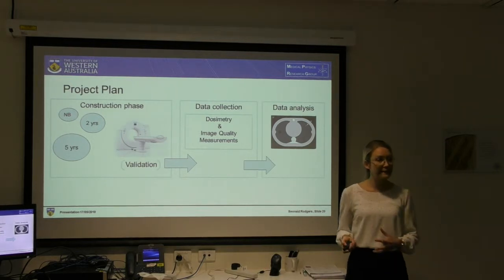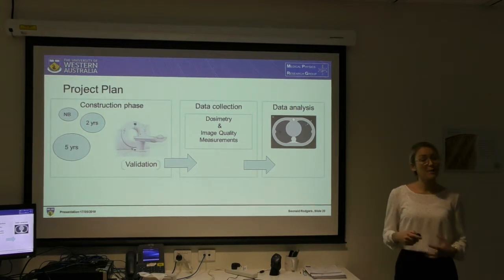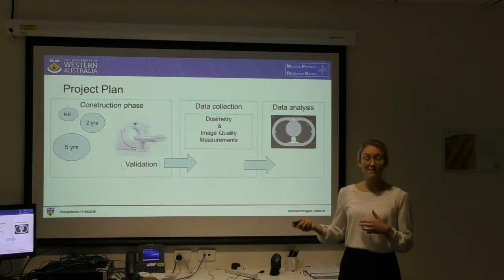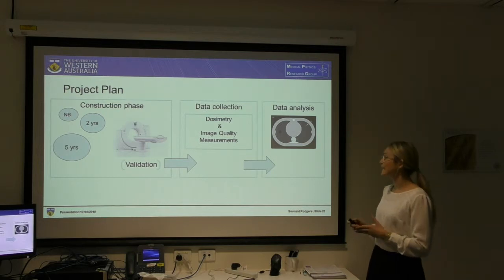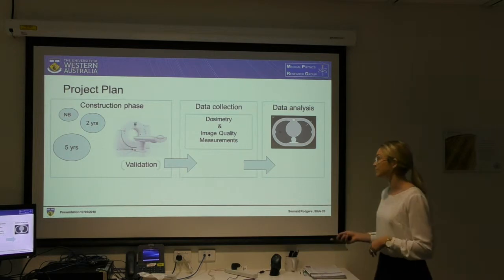My project plan consists of 3 main stages. Firstly, the construction stage, where I will be making paediatric chest phantoms. Once these phantoms have been validated, we'll be using them to take dosimetry and image quality measurements, and finally analysing this data to determine the dose reduction potential of tin filtration.